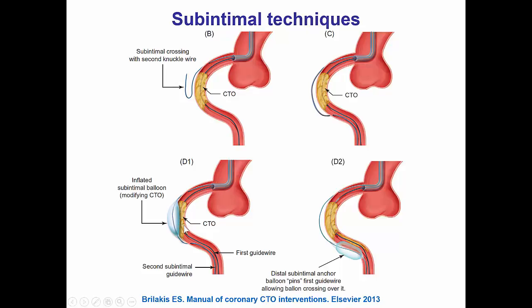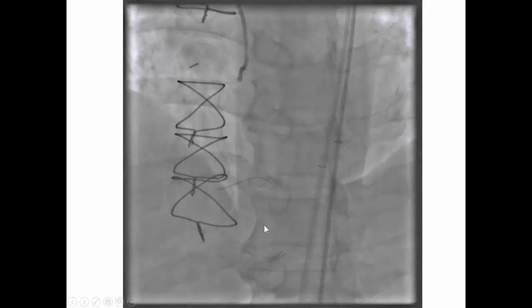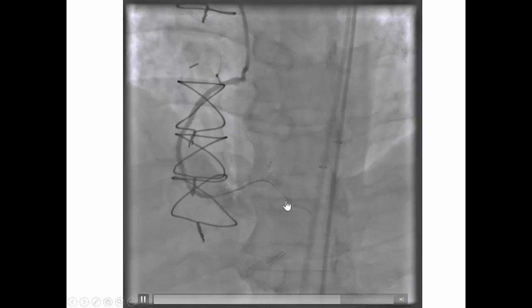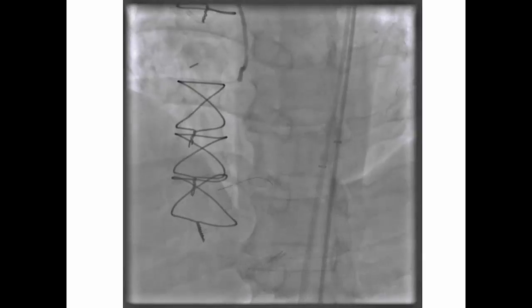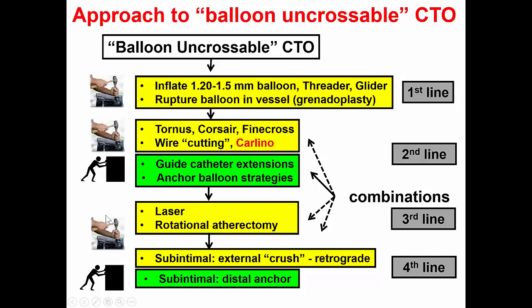And after doing that, we were able to advance a balloon through the initial true-to-true lumen guide wire and then pre-dilate and deploy stents. The vessel is very small and diffusely diseased, but we do know that these vessels grow over time when there is increased perfusion. In summary, balloon uncrossable CTOs are relatively common — approximately 1 in 10 CTOs will be balloon uncrossable — and it is important to have an algorithm and a step-by-step approach to successfully treat those lesions. Thank you.